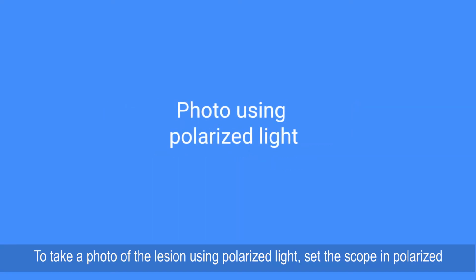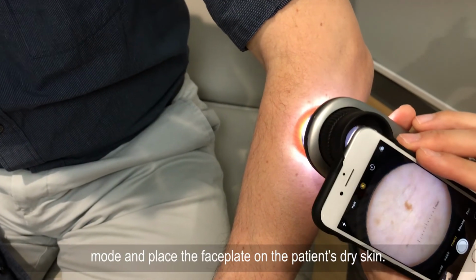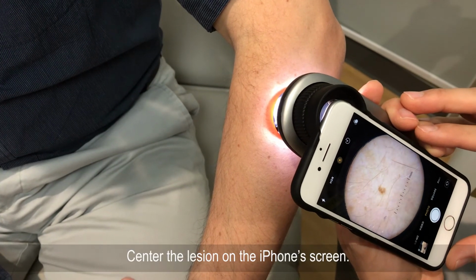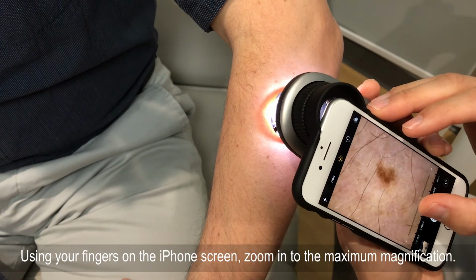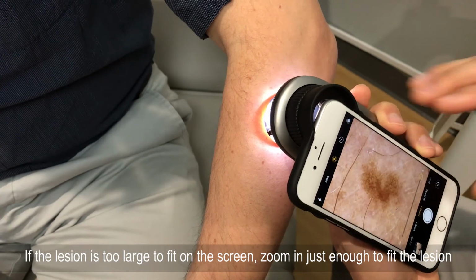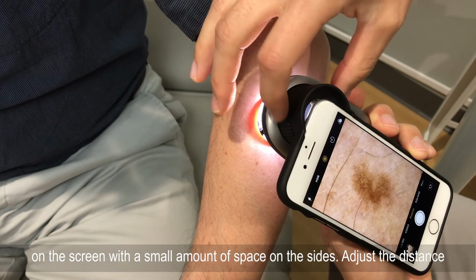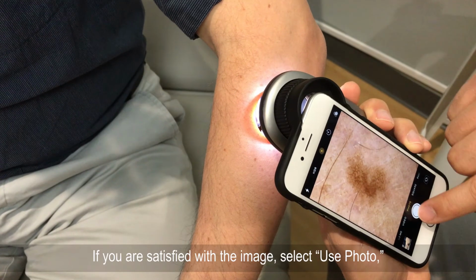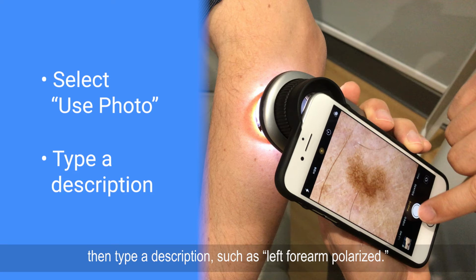To take a photo of the lesion using polarized light, set the scope in polarized mode and place the faceplate on the patient's dry skin. Center the lesion on the iPhone screen. Using your fingers on the iPhone screen, zoom in to the maximum magnification. If the lesion is too large to fit on the screen, zoom in just enough to fit the lesion on the screen with a small amount of space on the sides. Adjust the distance of the spacer so that the image is in focus and take the photo. If you are satisfied with the image, select Use Photo, then type a description such as left forearm polarized.